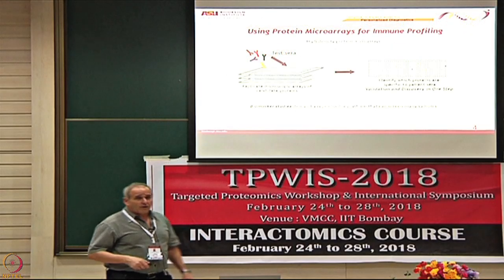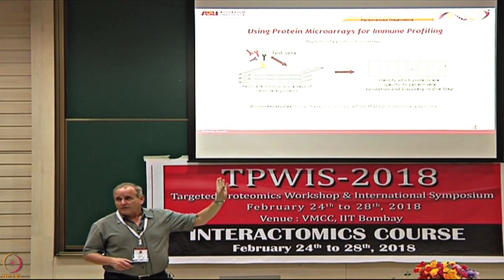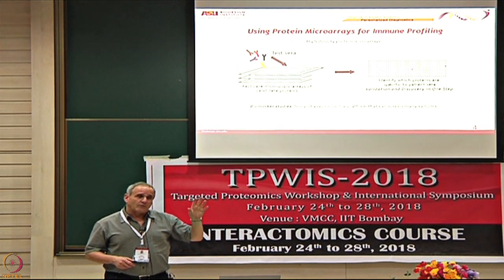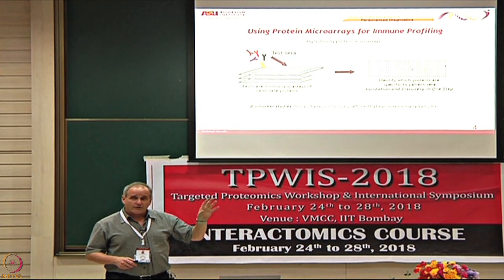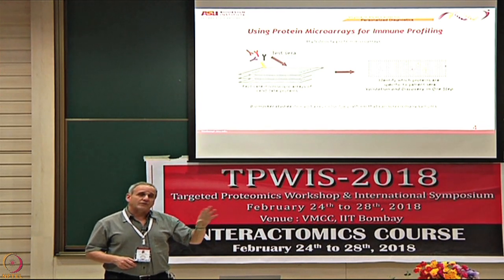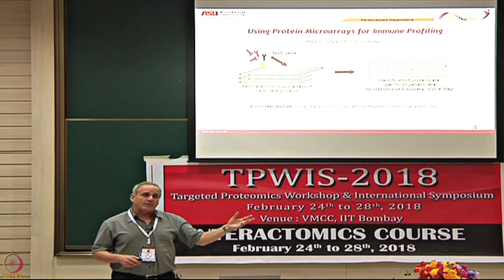For this method to work, you need to know that this protein array platform is reliable. You need to know that when you run it on different days using the same sample, you're going to get the same answer. Because it's one thing to do research and just hope that it worked pretty well and get some responses that you can then follow up in other studies.